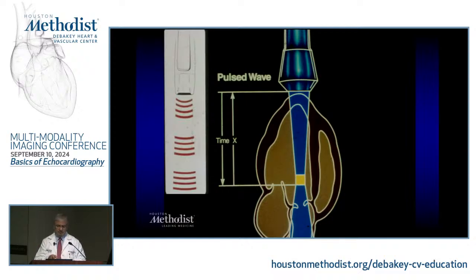So if I put this pulse Doppler, let's say in the LV outflow tract here, I send this burst of a packet of frequency, of wavelets, okay? Now, if I want to know at that level what happened to this frequency? Did it get compressed? Or did it get decompressed, if you will? What happened to it?